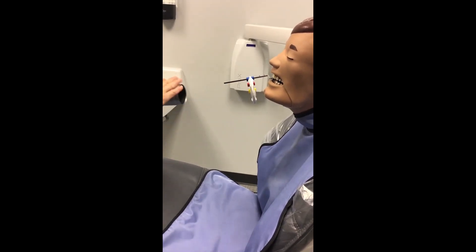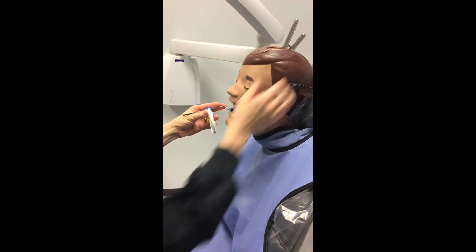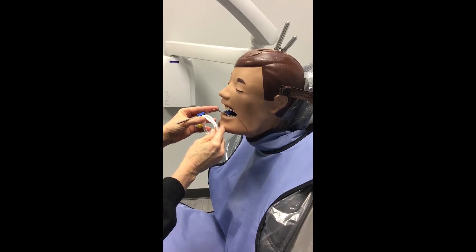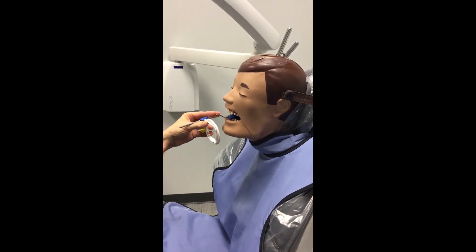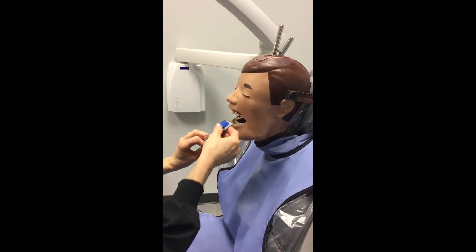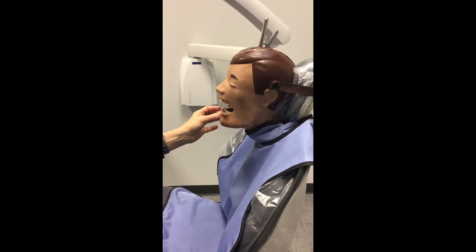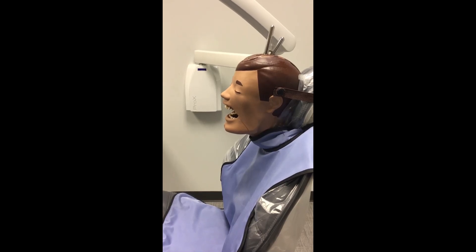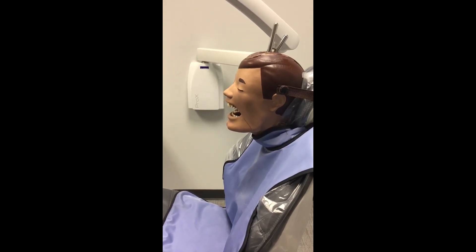For the mandibular lateral canine shots, just like the maxillary, take the bite block in as if you were doing a central, then rotate it around to your lateral canine, with the line right in between those two teeth. Have your patient bite down and line it up as normal. As a refresher: you will take three anterior projections on top — two lateral canines and a central — and the same on the bottom. Always make sure your bite block is touching the teeth you're taking, and that the teeth are centered on your sensor using the line on the bite block as a guide.